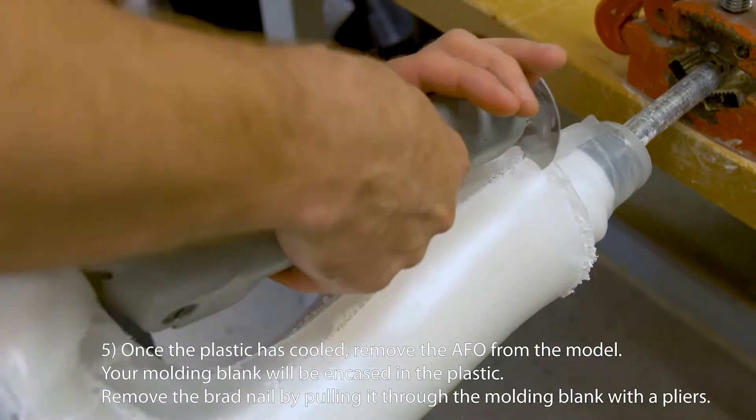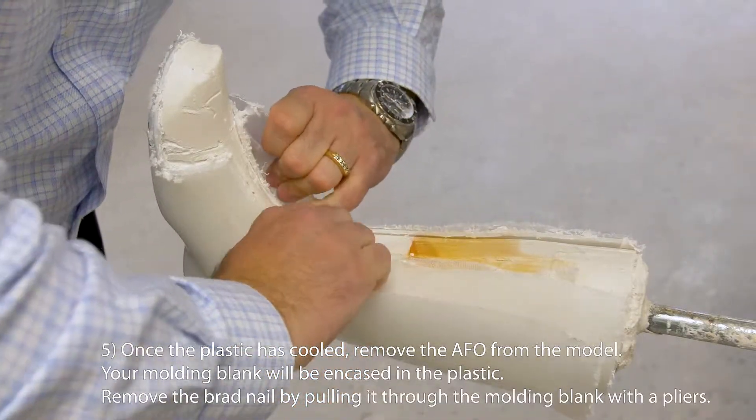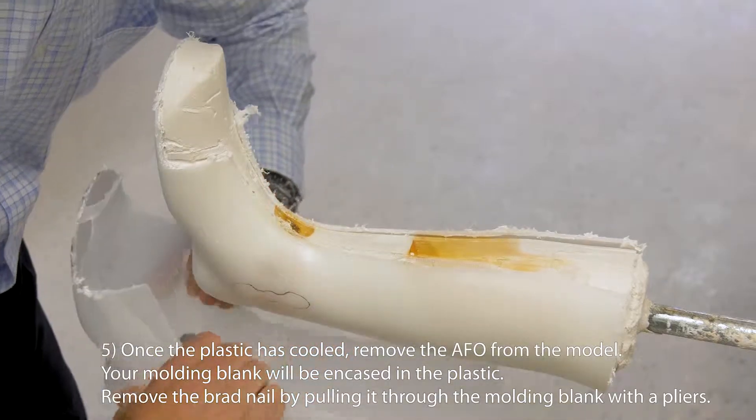Once the plastic has cooled, remove the AFO from the model. Your molding blank will be encased in the plastic.